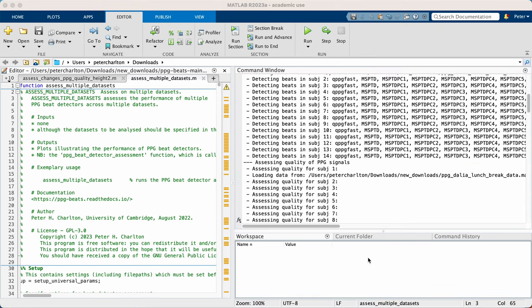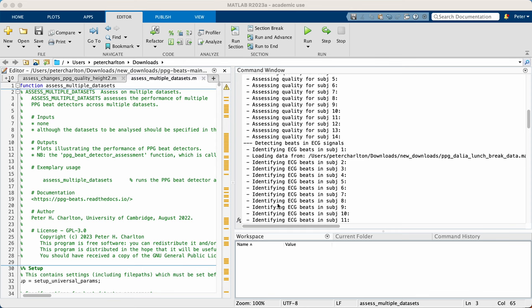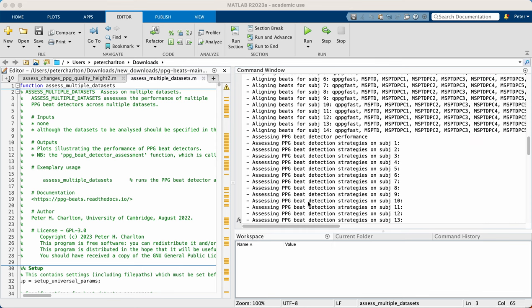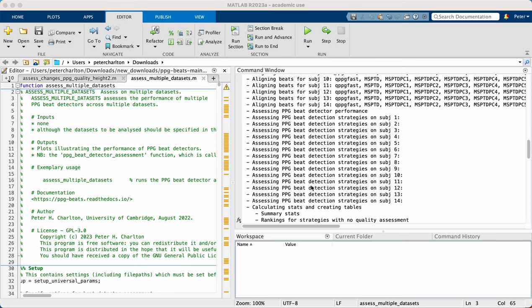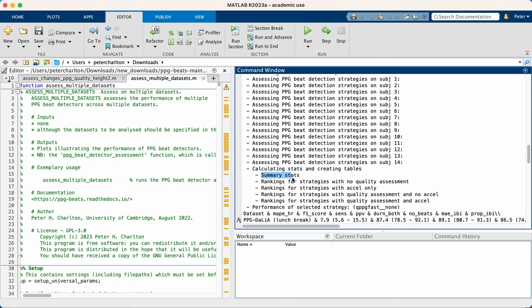Welcome back. When we left, the toolbox was detecting beats in each subject's PPG signals. Since then, it's gone through a few additional steps, such as identifying beats in simultaneous ECG signals, and assessing the performance of each beat detector. It's produced these summary statistics for the performance of each beat detector, which is what we're now going to look at.